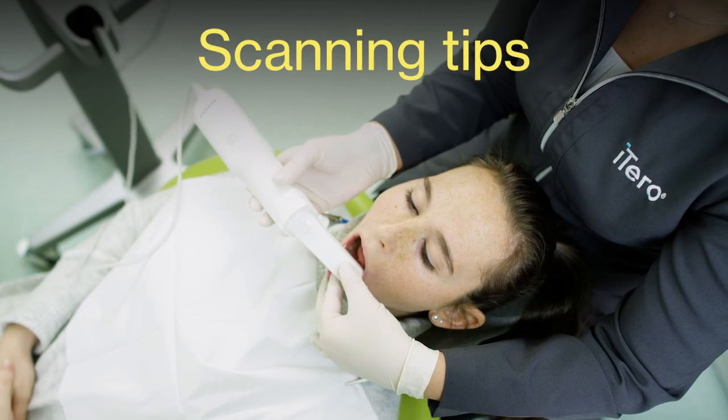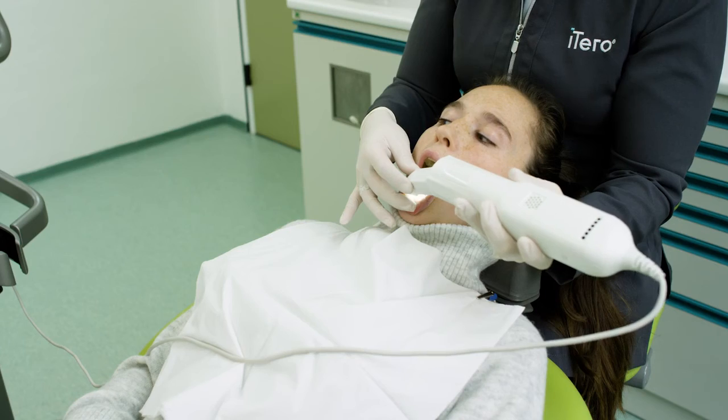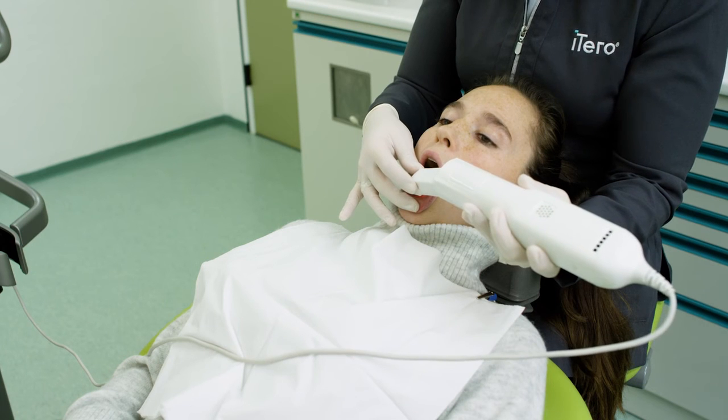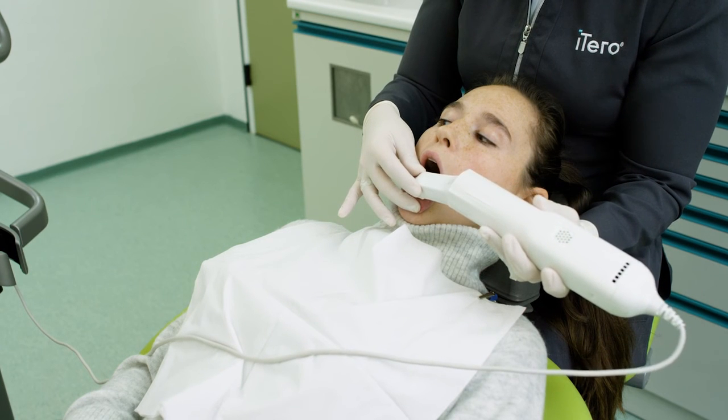When scanning, the hand that is not holding the wand should be used to fulcrum and retract the soft tissue.